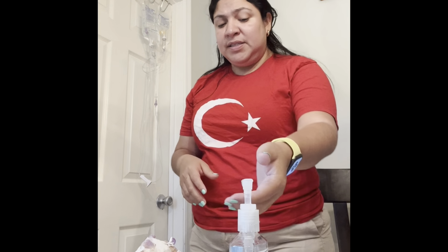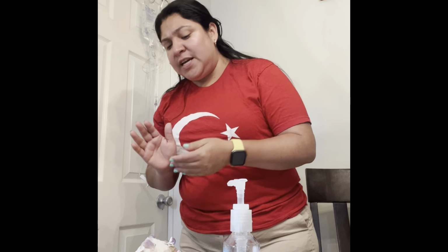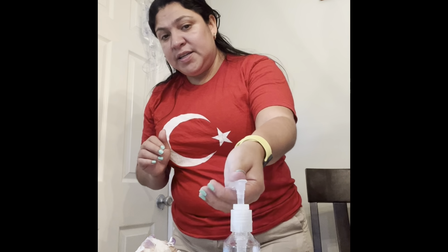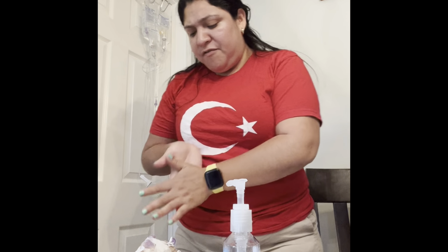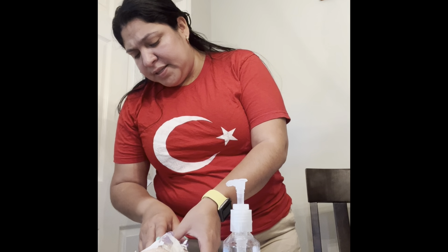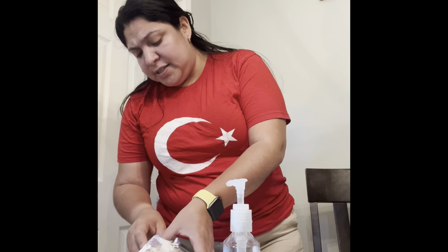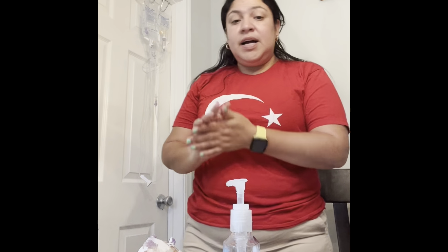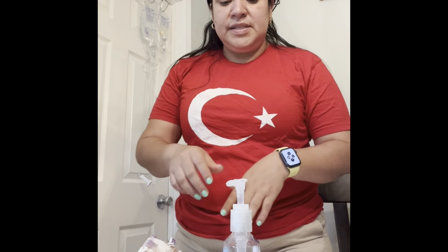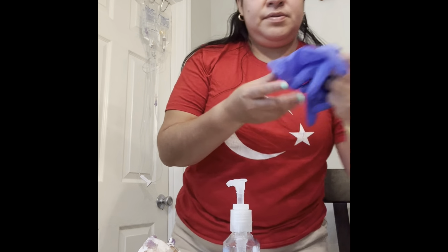Patient stated yes. Let me just verify your identification, please. Can you please state your name and date of birth? Clean my hands again. Grab my patient's arm. Patient said Rene Adams, May 25th, 1978. Yes, I have Rene Adams, May 25th, 1978. After that, I am going to inspect the IV access. I'm going to clean my hands again. Put on gloves.